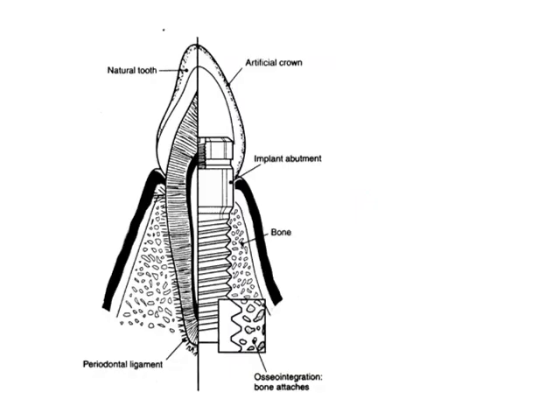Note in this photo that there's no fiber attachment, very little attachment, just enough to form a new sulcus around the crown. So we do probe around implants, but we're really just probing around that area right underneath the crown up into the screw when we're talking about fiber attachment.